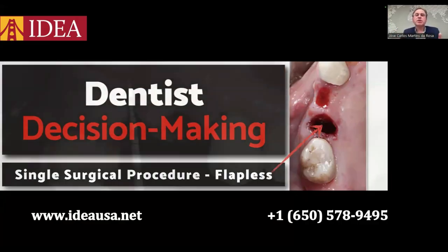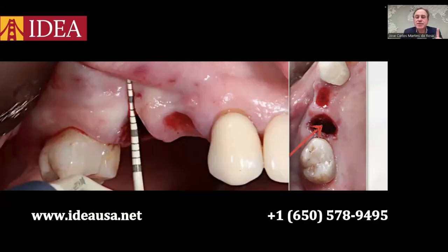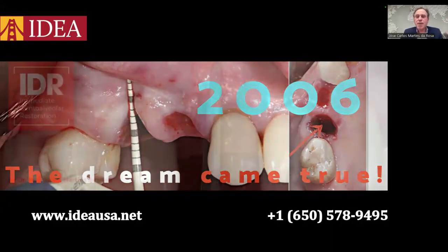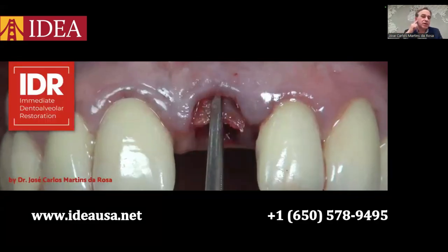In the second premolar zone, the patient lost completely the buccal wall, and since 2006, our dream came true. We developed the IDR technique to manage this challenging clinical case in one single session without open flap. What's the main concept of this technique? To use the best bone graft ever: the bone graft harvested from the maxillary tuberosity.